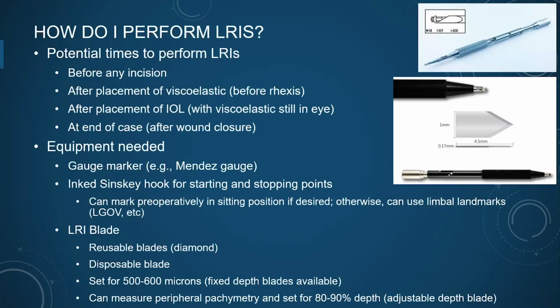These are usually several thousand dollars each. Some surgeons operate in facilities where there are other cases besides eyes, such as ortho or gynae, and you don't want your diamond blade tossed in with a bone saw or whatever ortho does, and get damaged. So for that reason, there are disposable blades available.